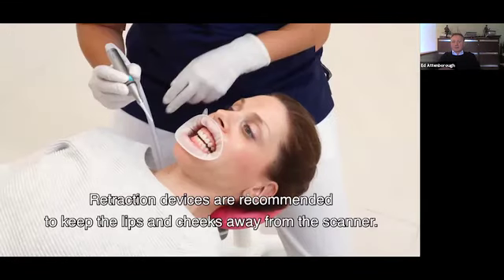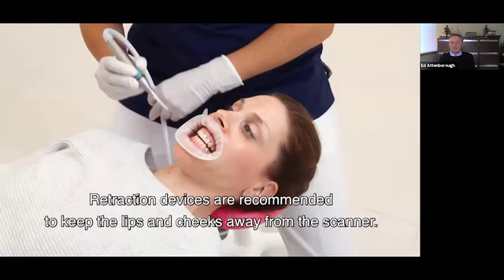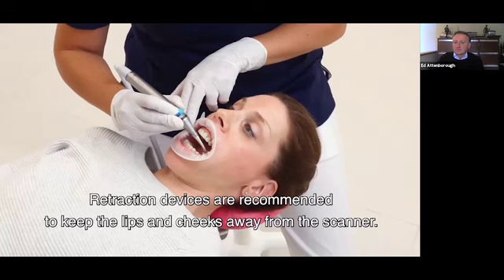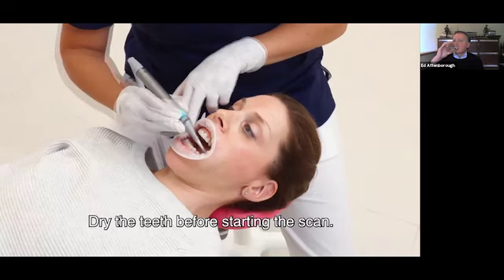Retraction devices are recommended to keep the lips and cheeks away from the scanner. Dry the teeth before starting the scan.